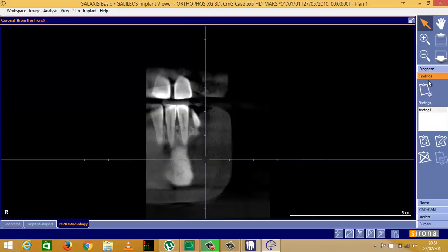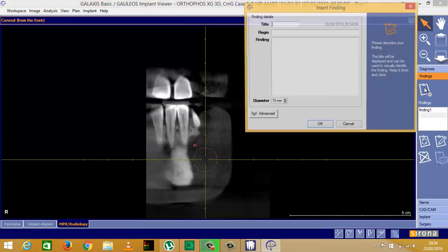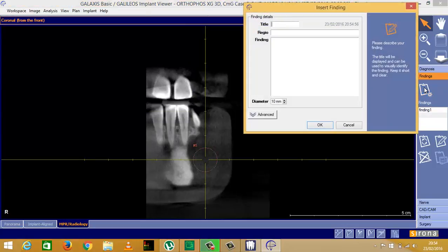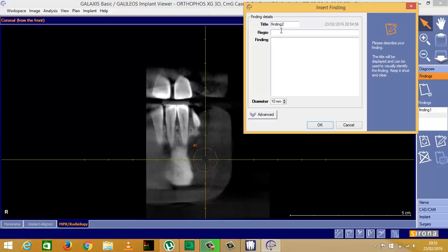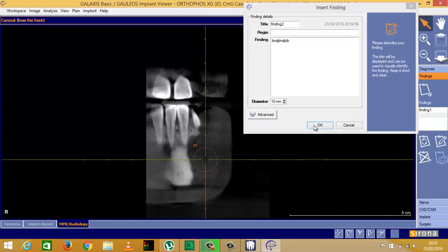Now I click on finding. I'm going to call this one finding two. You can call it anything of course. Region if you wanted to put in the region there. For finding, I'm just going to type anything in there. Click OK.